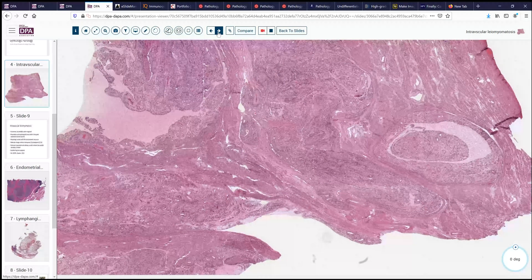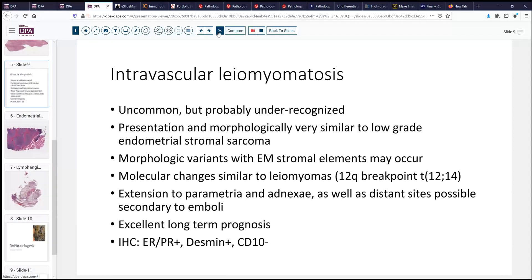Our leading consideration here would be intravascular leiomyomatosis, or intravenous leiomyomatosis. This is an uncommon but probably under-recognized entity, particularly since we don't always sample the parametrial tissues where early indications of this might appear. The presentation tends to be very similar to low-grade endometrial stromal sarcoma — mild uterine enlargement, a worm-like growth pattern that may extend beyond the myometrium. There are several morphologic variants with various stromal elements that may be present.